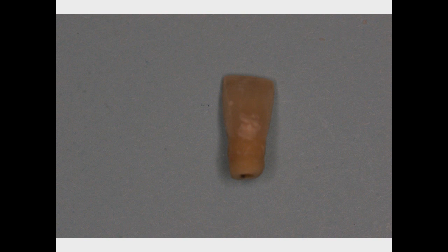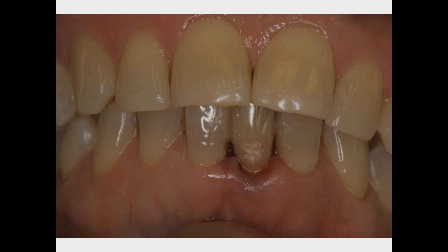A modified root canal was performed on the coronal portion of the remaining tooth structure. The tooth was then carefully prepared and placed for cementation using the teeth on either side as support with a material called ribbon.